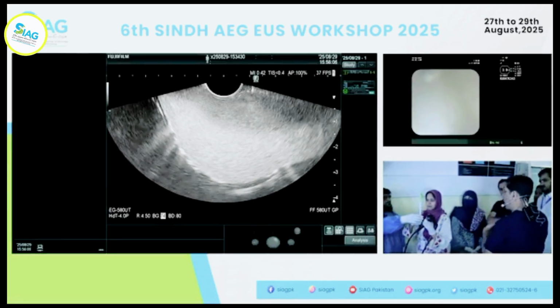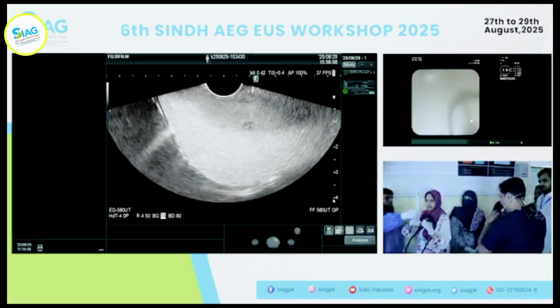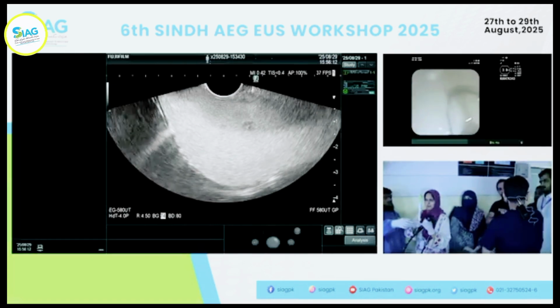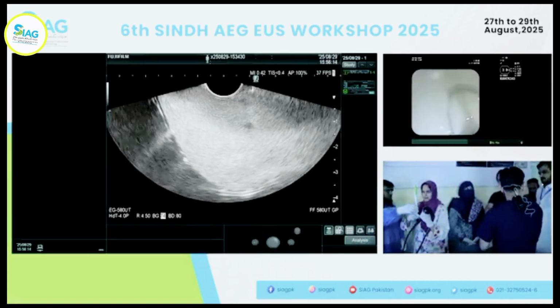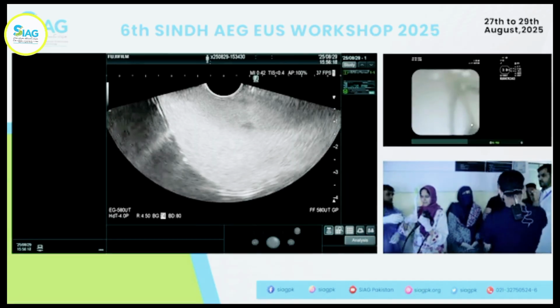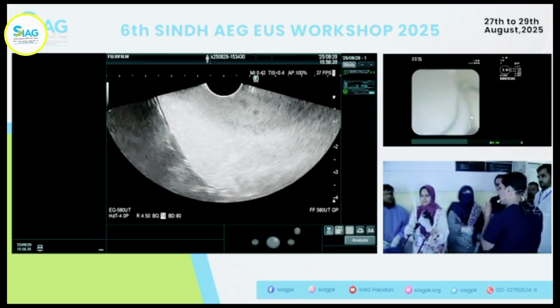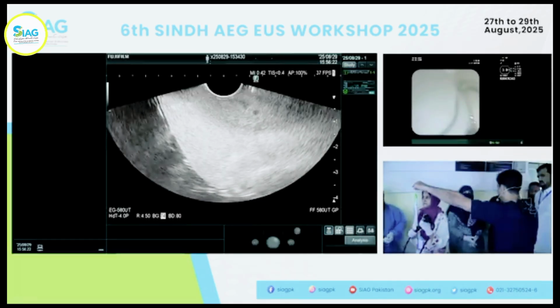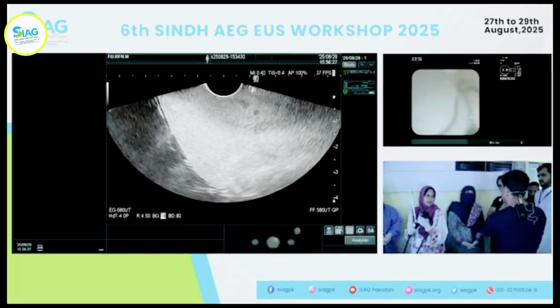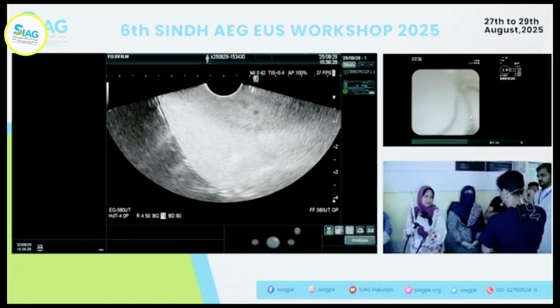The other thing is, there are different techniques, but intermittent suction. As you're going in, you keep the suction on. So in, suction on, out, suction off. Third thing is, the suction we use, in, out. On the way in, suction on. On the way out, suction off.